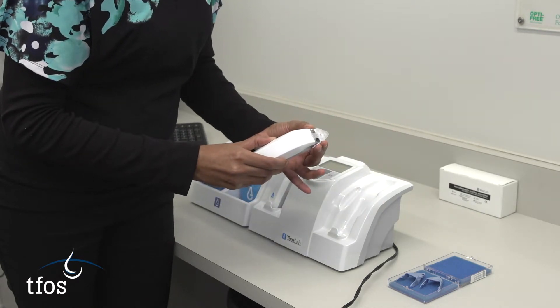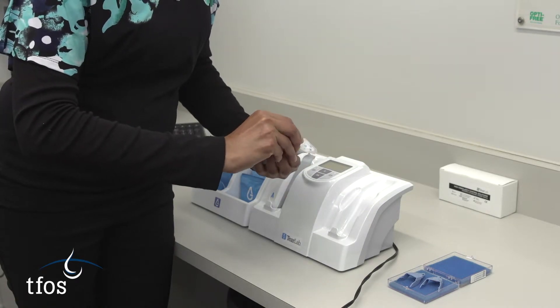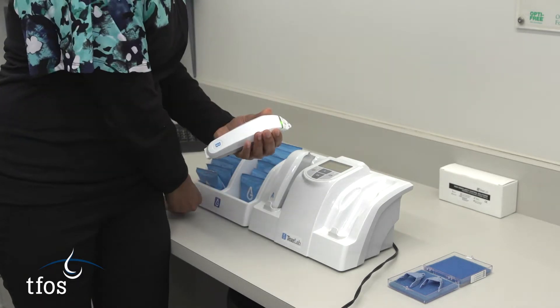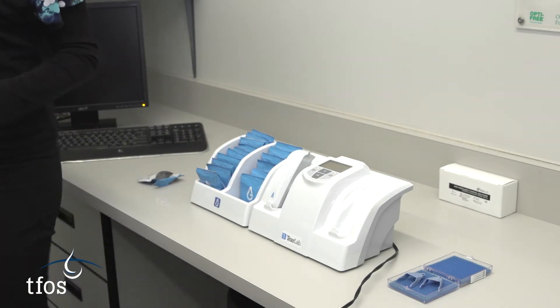The operator then has two minutes in which to collect the sample after removing the plastic cover from the test card. Delayed sample collection results in the timing out of the device and the procedure would need to be started over with a new test card.